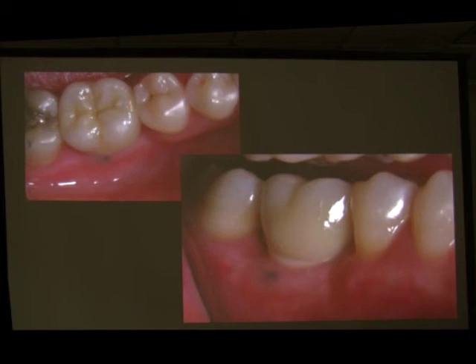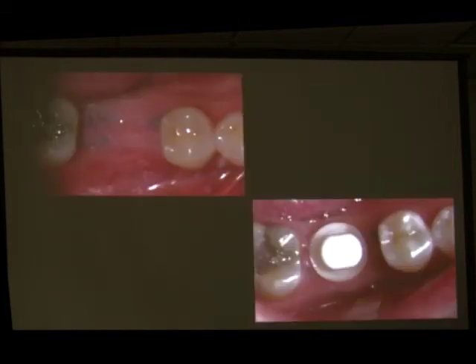We never, in posterior sides, we never prep the implant. We like to keep it simple, plus we like to keep the implant strong. We know that if we don't modify the implant at all, in 20 years' time, for sure, it will still be in the mouth. The more we grind them, the more difficult it is to know what type of modification we do on the implant. So, before, after, and just by placing the gum on the facial. When you put the gum on the facial, you don't have to suture the gum to the lingual, because when you suture the gum to the lingual, the gum goes too much to the mid-crest. You have to suture mesial and distal.